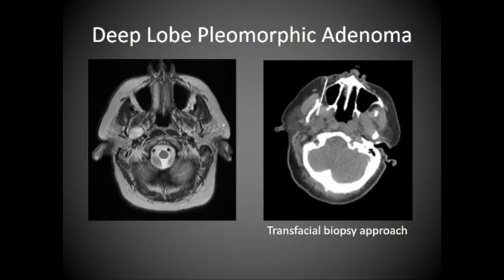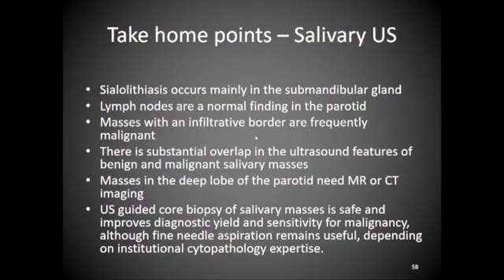The final approach, for a more anterior superior lesion: again, I love ultrasound, but I will occasionally switch over to a CT biopsy with a transfacial approach. This looks crazy, but I give them plenty of conscious sedation. This is actually very well tolerated, just using a skinny needle FNA.